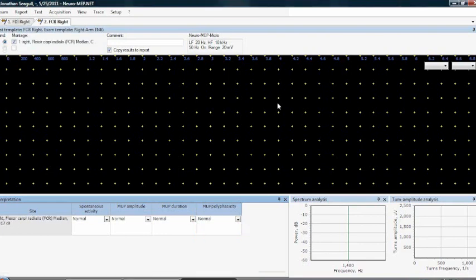And in the case of the upper extremity, the next muscle that we do is the flexor carpi radialis. And again, you study the motor unit potential, measure the duration, amplitude, latency, so forth and so on. And you fill in the information here below so that it goes to your report. Also on this side, you get an instantaneous analysis of the turns and amplitude of your signal and of the spectral analysis of your signal as well. Again, then you press next, and then test next, and test next. It's going to take you to all of the muscles that are in that template.